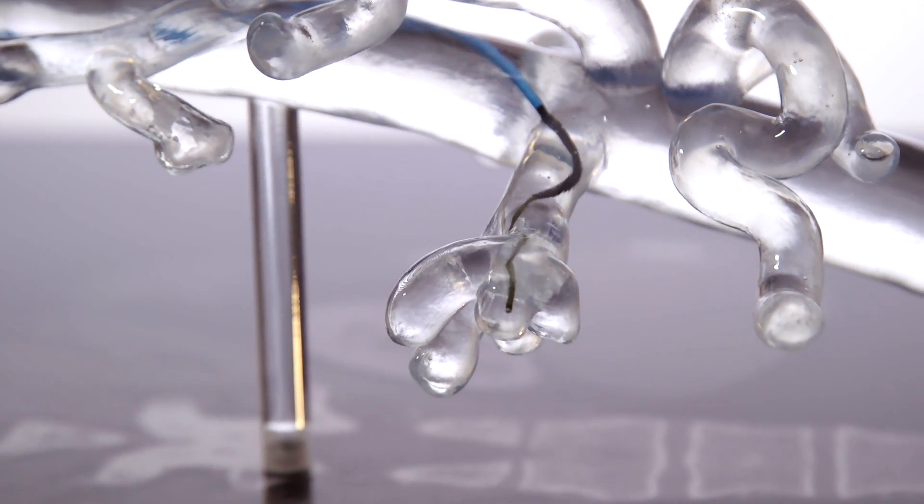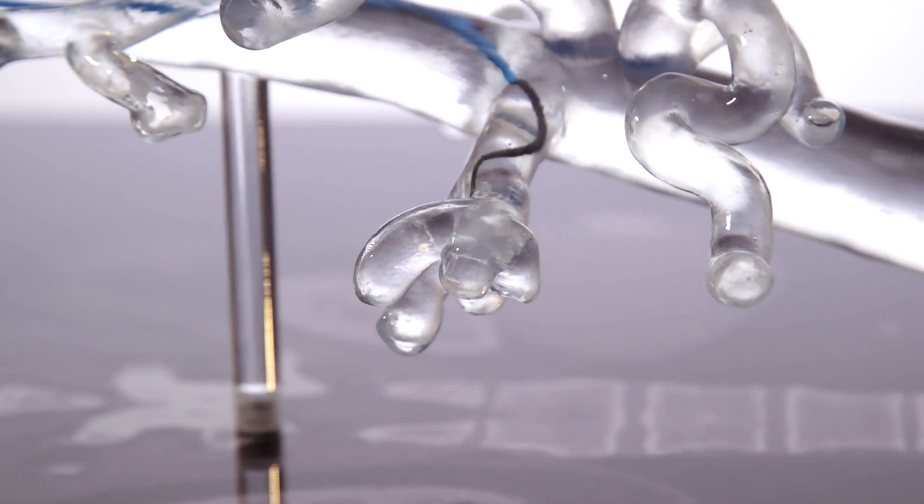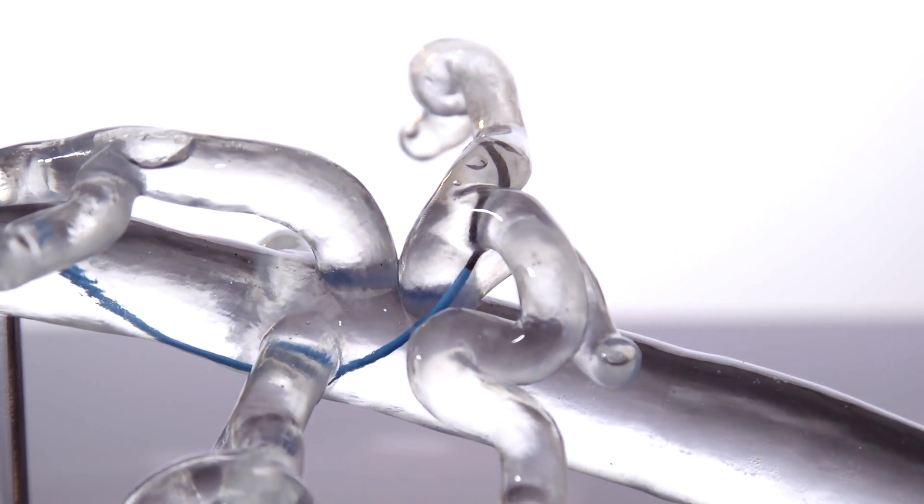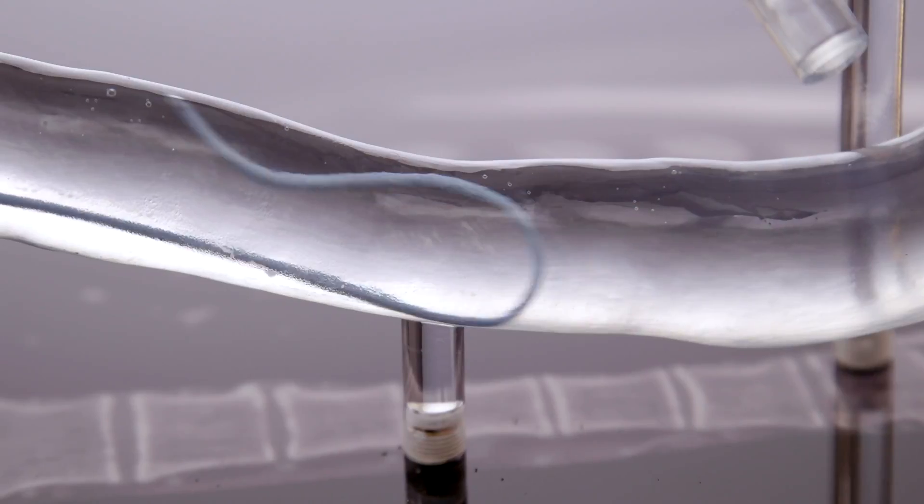The key benefit of Arteriosim is that you can become more familiar and comfortable with the skills that are essential for safe endovascular practice. This can be done inside an anatomically accurate environment and using the tools that you would in normal day-to-day practice.